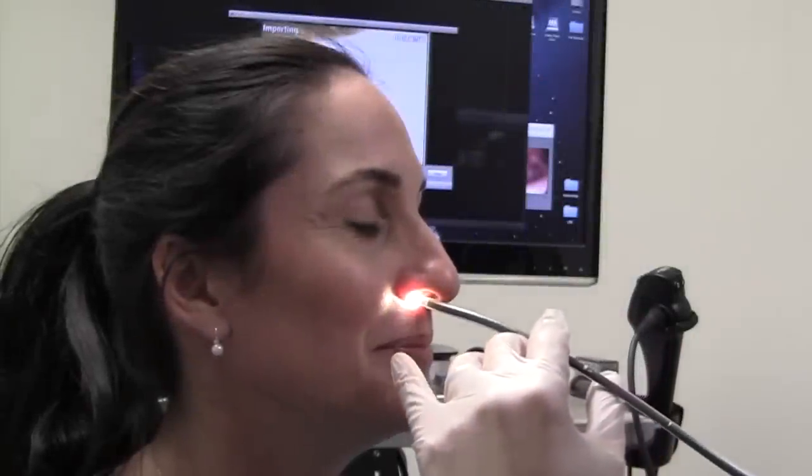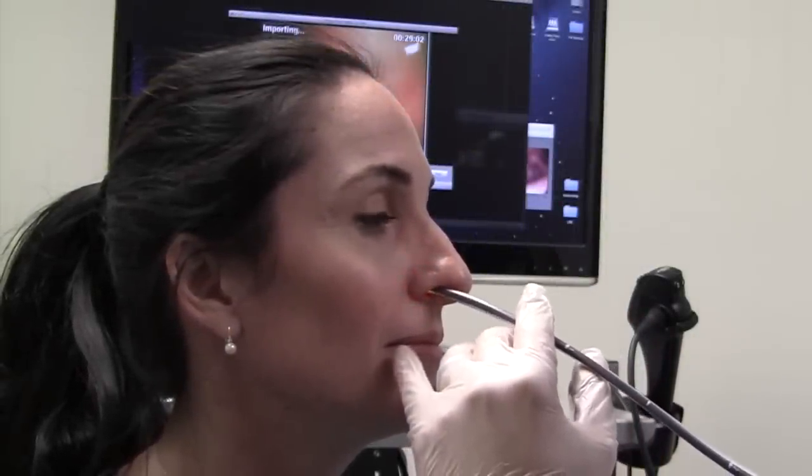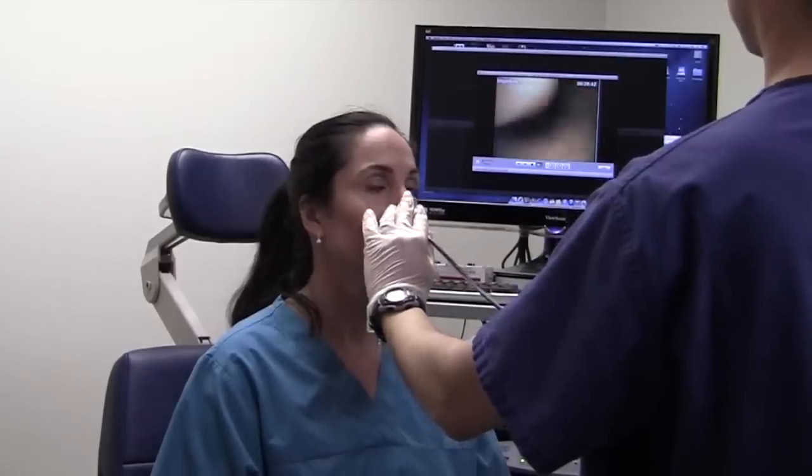Usually performed if there is concern for reflux or esophageal cancer, this exam is performed by passing a scope through the nose after adequate topical anesthesia.